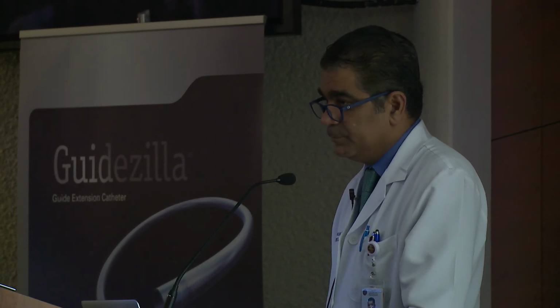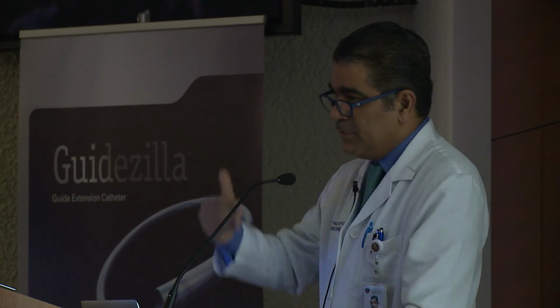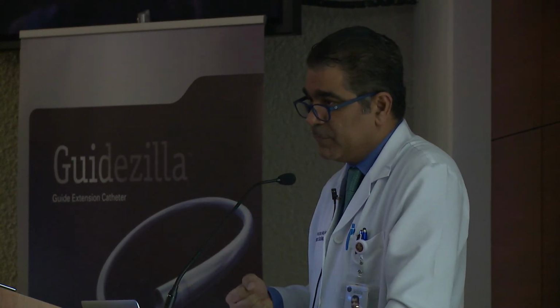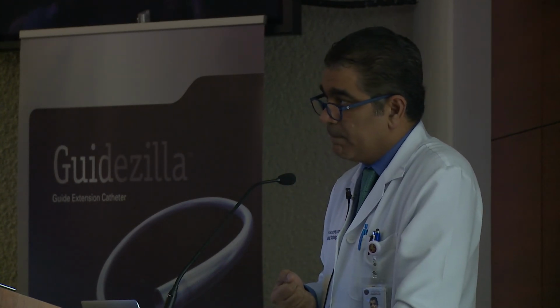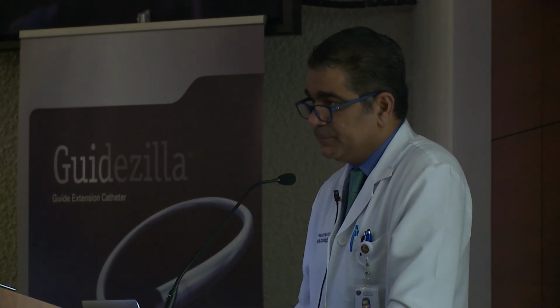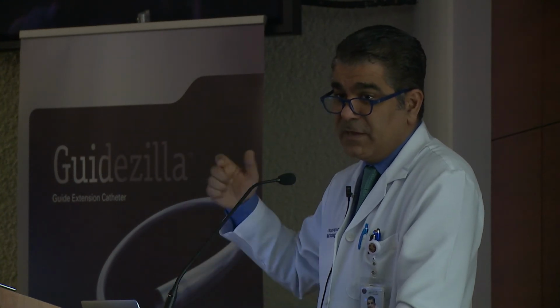What's the solution? If you come retrogradely, and there is a distal cap in here, and you have a short attack angle, you can't push enough. You escalated the wire, you still can't push enough. What's the solution? You're trying to dissect, but you don't have enough pushing power, so you want to increase it. Bring the microcatheter as near as possible, which pushes everything out to you. Change the wire, escalate the wire. What else? Any specific microcatheter? Changing the angle of your wire?